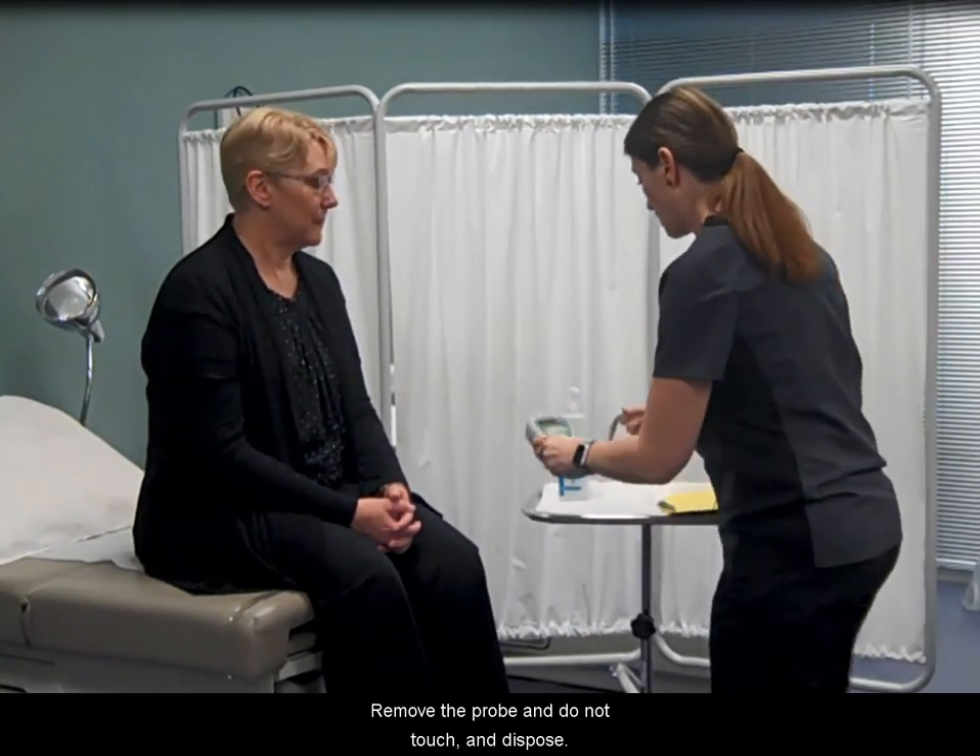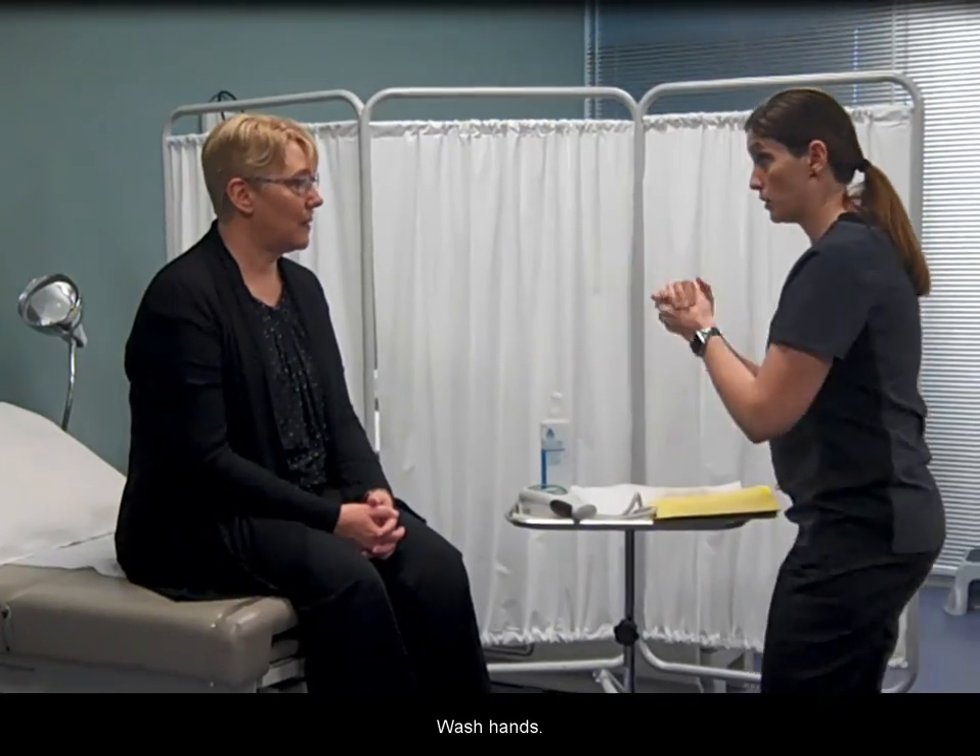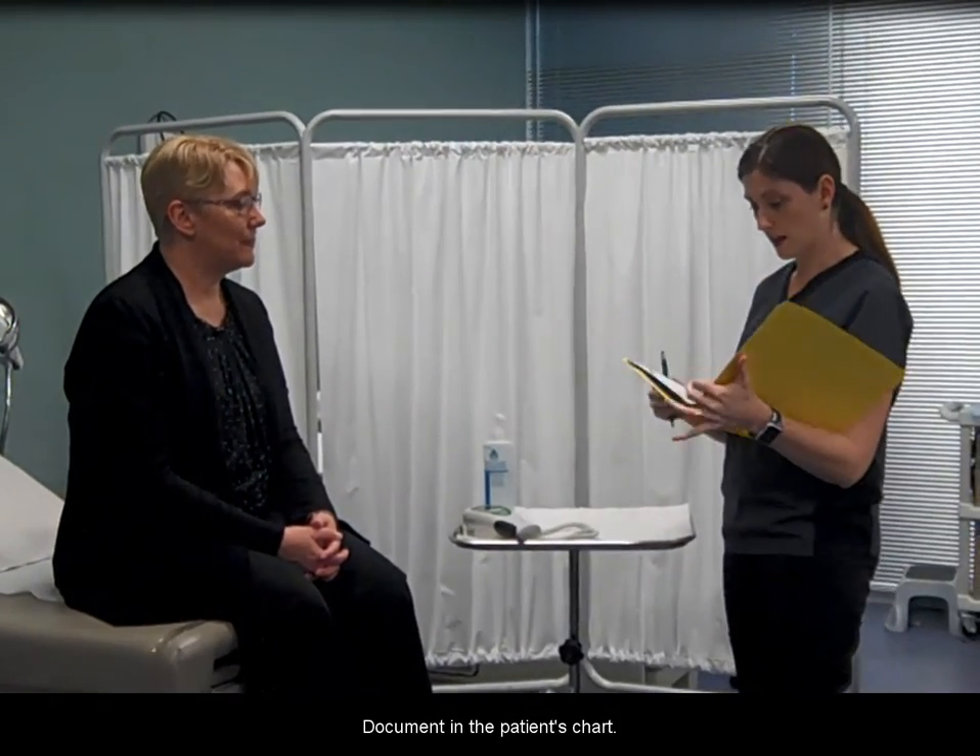Remove the probe, do not touch it, and dispose of the cover. Wash hands. Document in the patient's chart.